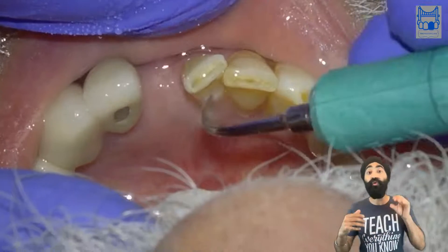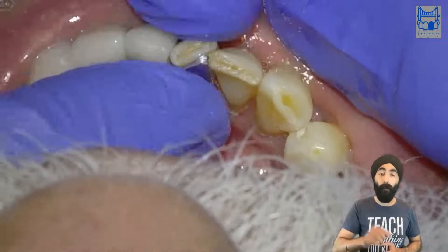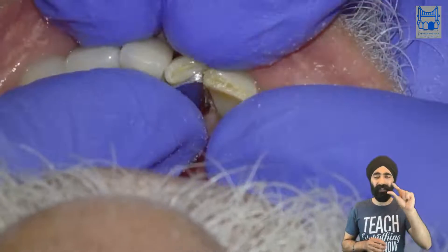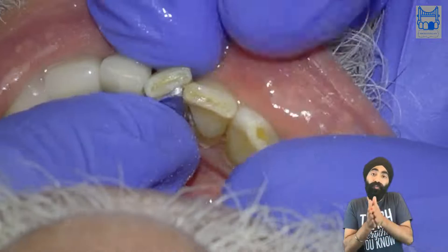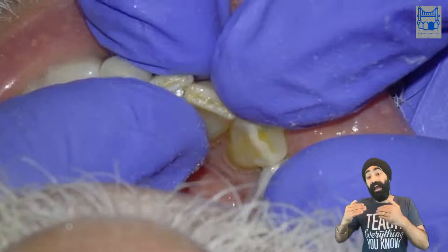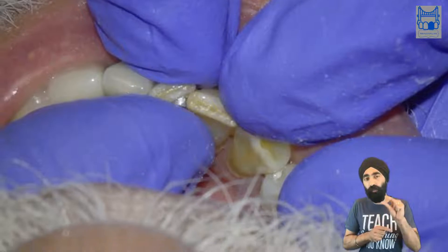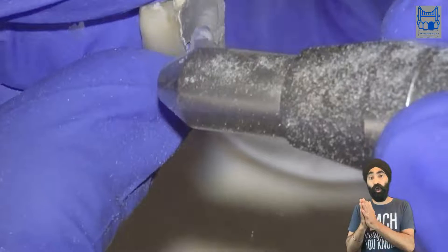After thorough cleaning, that gives us an opportunity to retry and rehearse the bridge again. That is now fitting much better, much nicer. I've rehearsed it with my fingers — I know how this feels, I know how the contact area looks on the adjacent incisor. So when I actually come to cementing it, I know what the feel will be like. It's really important to feel the fit so you can do a good job when you go back to cement.